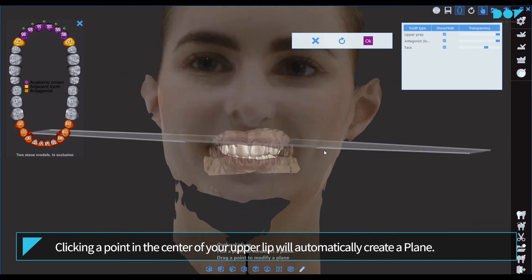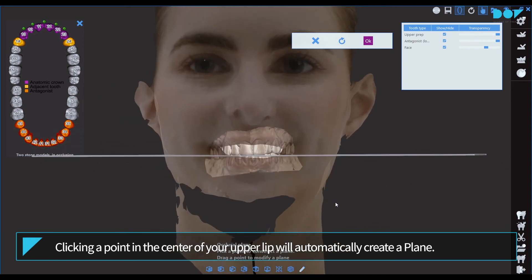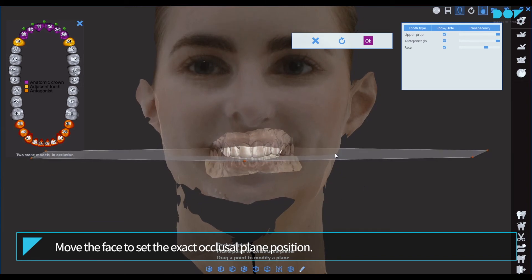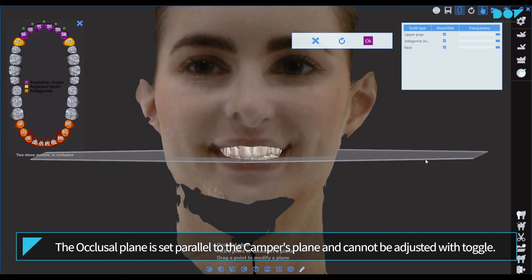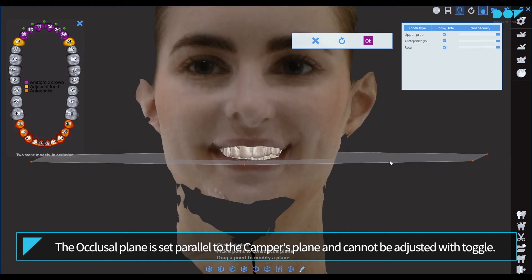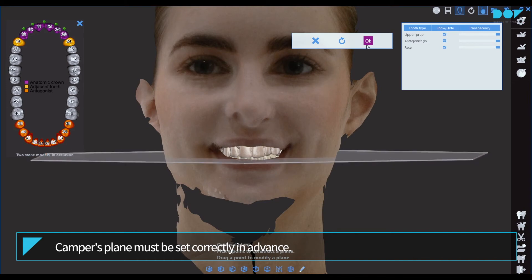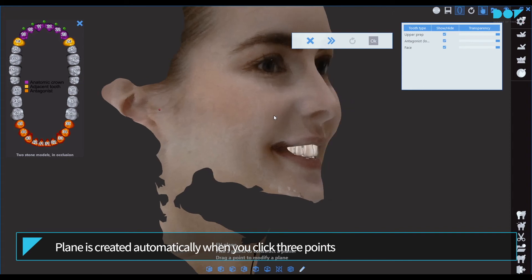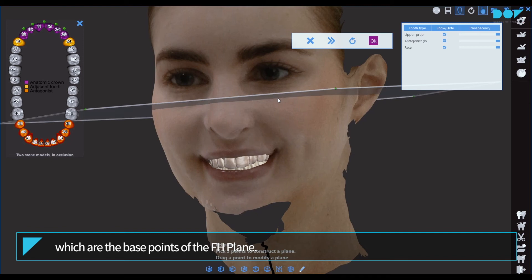Clicking a point in the center of your upper lip will automatically create a plane. Move the face to set the exact occlusal plane position. The occlusal plane is set parallel to the Camper's plane and cannot be adjusted with toggle, so Camper's plane must be set correctly in advance. The FH plane is created automatically when you click three points which are its base points.